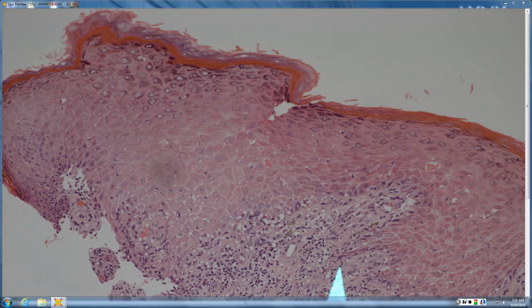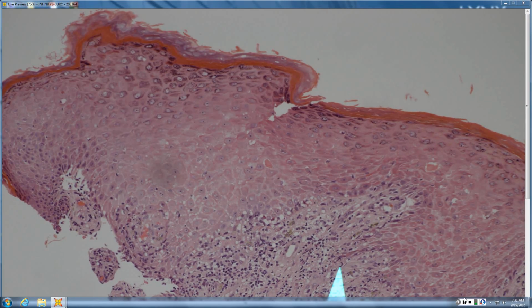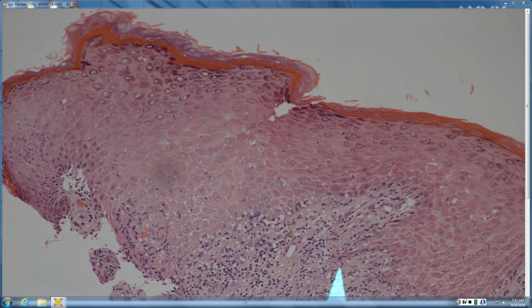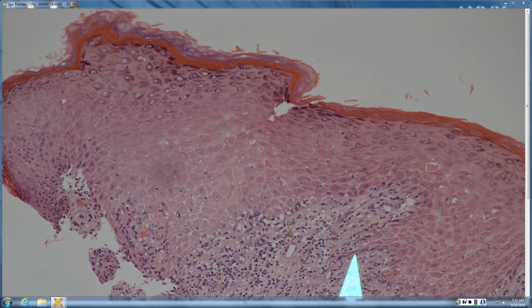And it's important because you're in a different differential then, right? Correct. So once again, vacuoles you see in anything interface. The difference between vacuolar and lichenoid interface is in vacuolar interface, your basal layer is intact with vacuoles. In lichenoid, it's destroyed with vacuoles. And evidence of destruction includes sawtoothing, dead reds, necrotic keratinocytes at the junction, mummified dead reds, which are Civatte bodies.